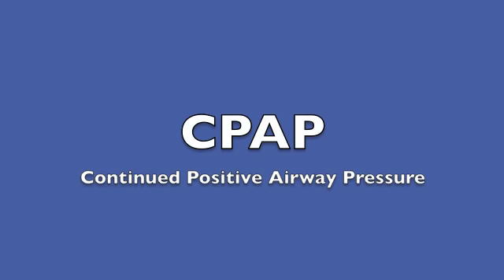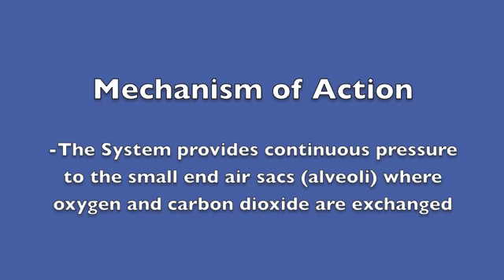Welcome to the lecture on CPAP, which is continuous positive airway pressure. CPAP works by providing continuous pressure both during inspiration and expiration to the small end air sacs called alveoli, where oxygen and carbon dioxide are exchanged.